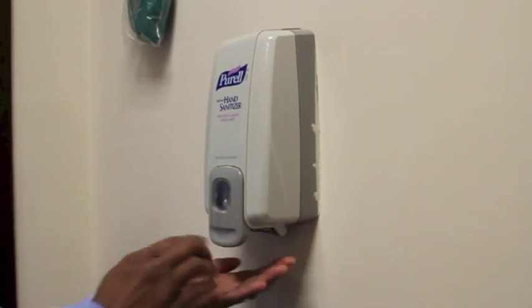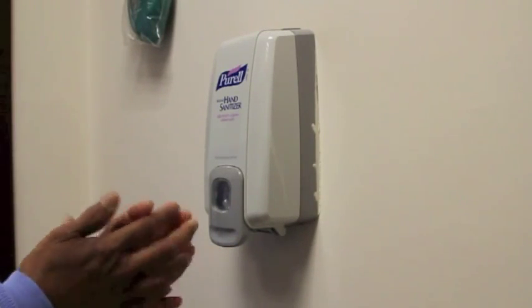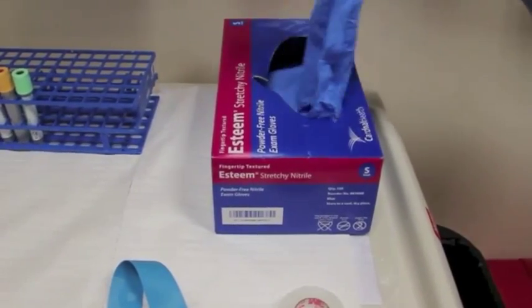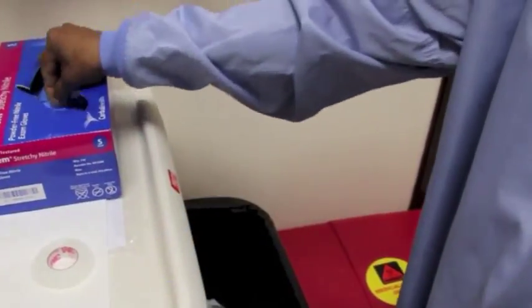After washing or sanitizing her hands, the phlebotomist dons clean gloves, taking care not to contaminate them at all. The phlebotomist needs to choose the correct glove size, otherwise if too small or too large, it could interfere with the procedure.